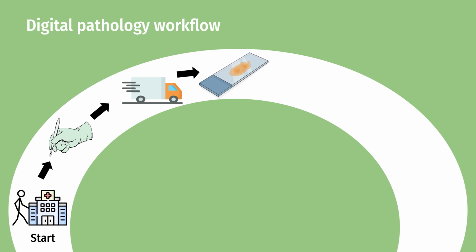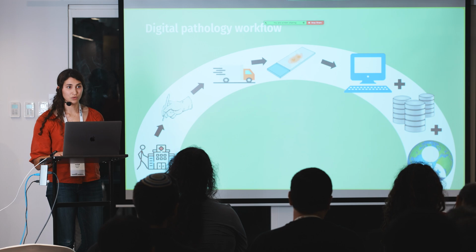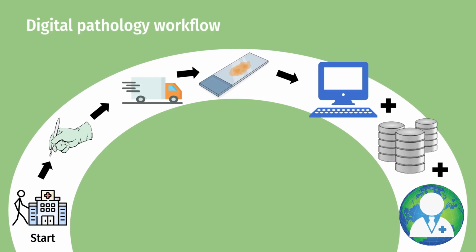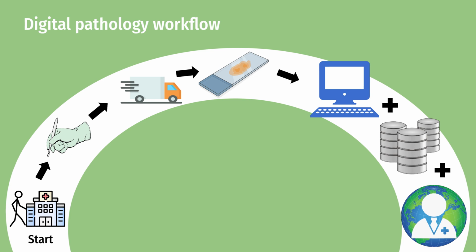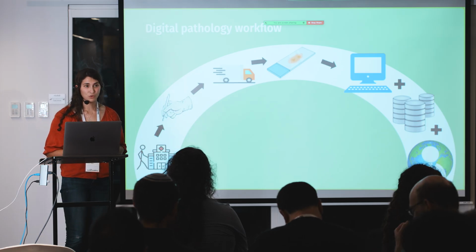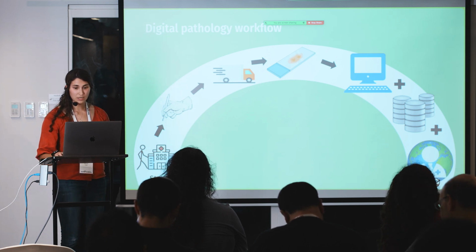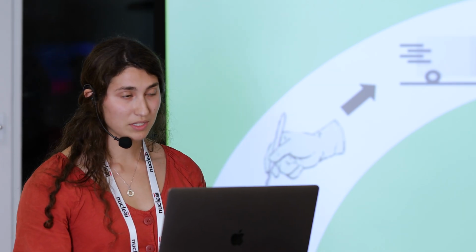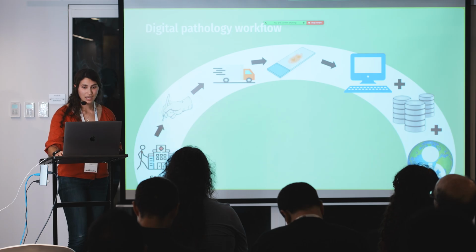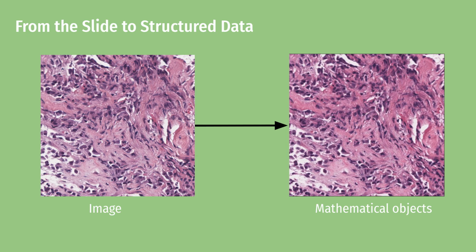So how does digital pathology come to disrupt this workflow? Once the tissue is cut and placed on our glass slide, rather than physically transporting it back and forth to the pathologist and analyzing it in an analog way, we can digitize the slide and upload it to a database or a file system. This allows us to not only have the slide analyzed by pathologists anywhere in the world at any time, but also to use tools like artificial intelligence to improve the accuracy of our analysis and extract more quantitative insights from our slide. So let me explain what I mean.